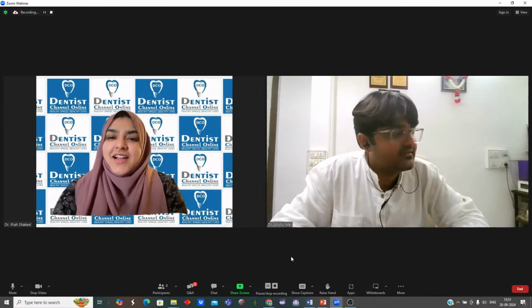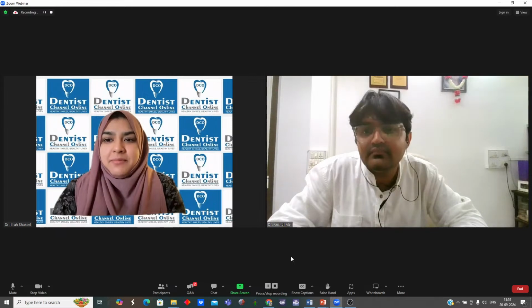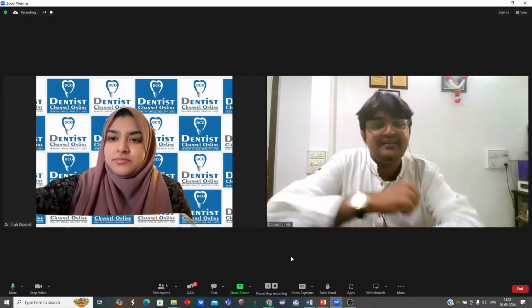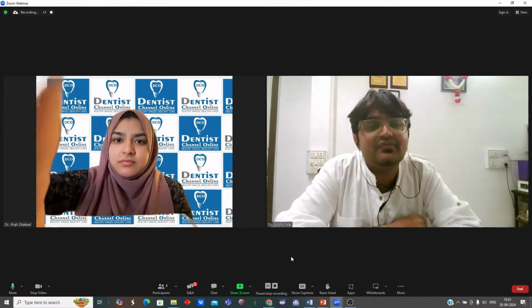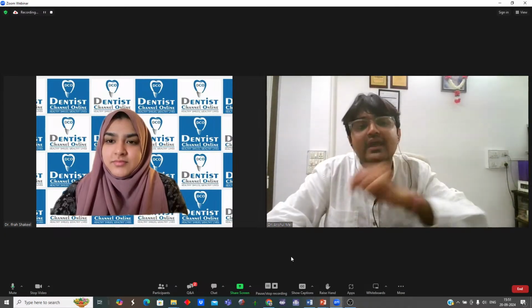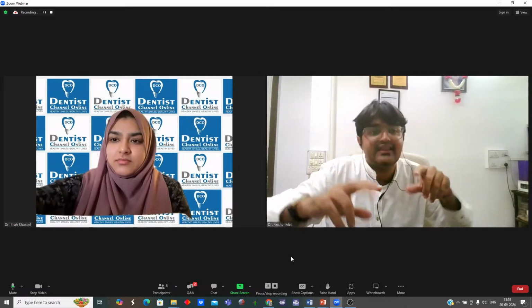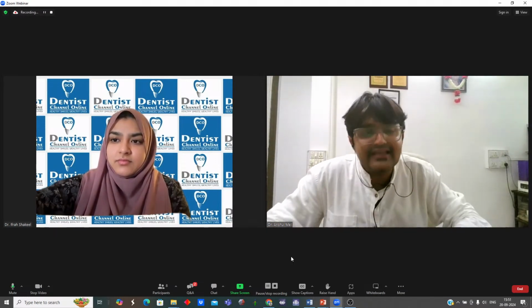The next question is, for guided dental implant placement, which type of surgical stent do you prefer, 3D printed or milled? Yeah, a good question. In that, I will prefer the milled one. But you cannot use that guide for all cases. One implant, two implants, they are parallel, so you can plan it. But if it is a tilted implant case, you are not able to mill it, because the implants have different directions, and the milling machine cannot mill all the different directions. So the best thing is printing.